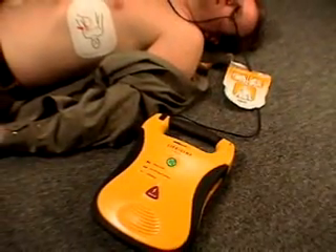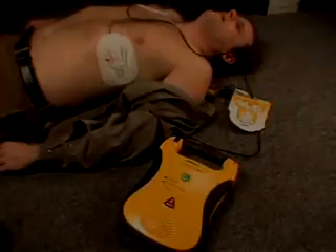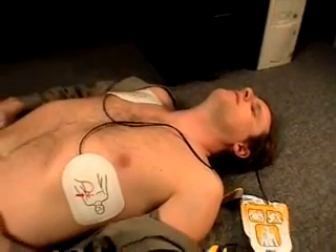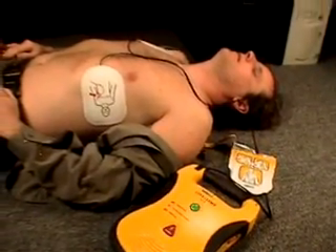If, at any point, a shock is no longer required, the unit will not allow a shock to be delivered to the victim. No shock advised. The Lifeline AED will not shock a victim that does not require a shock.